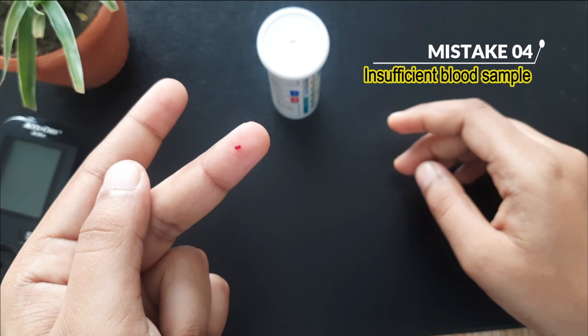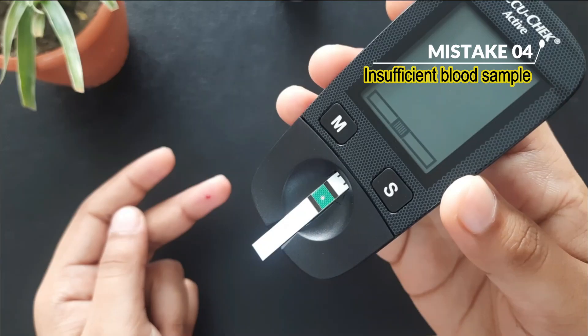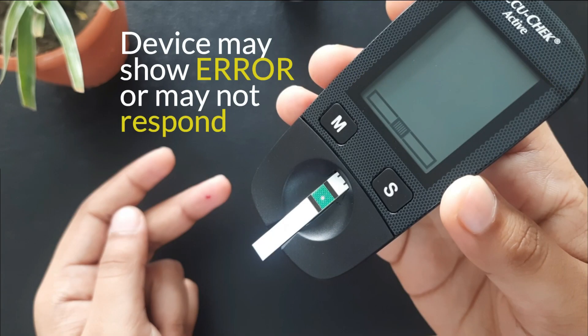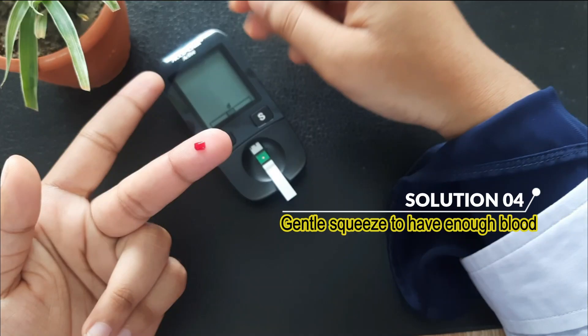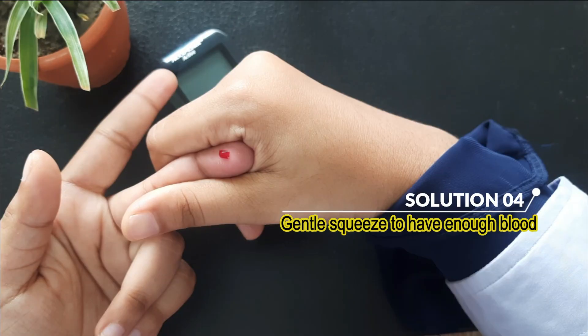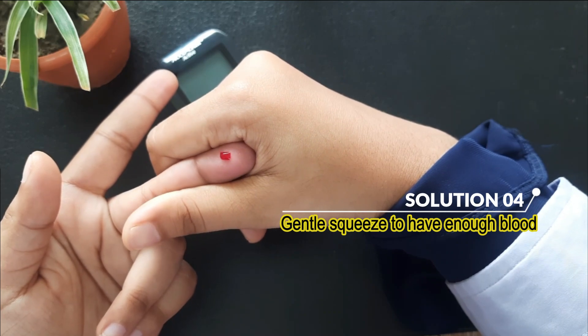Mistake 4: Insufficient blood sample. Solution is, make sure you have enough blood for an accurate reading. Apply gentle pressure if needed.